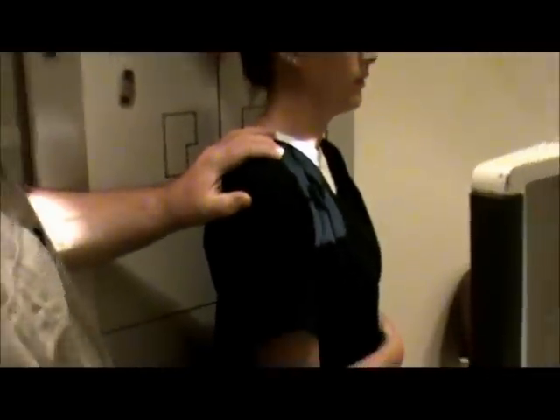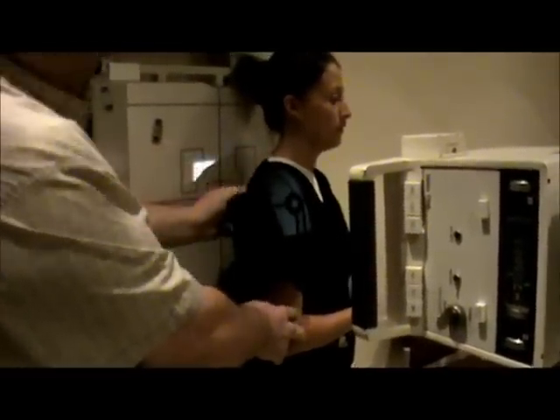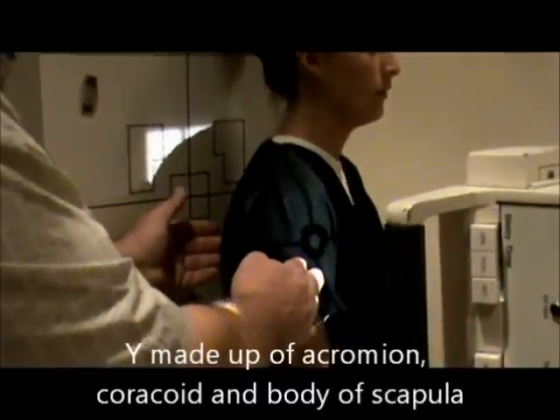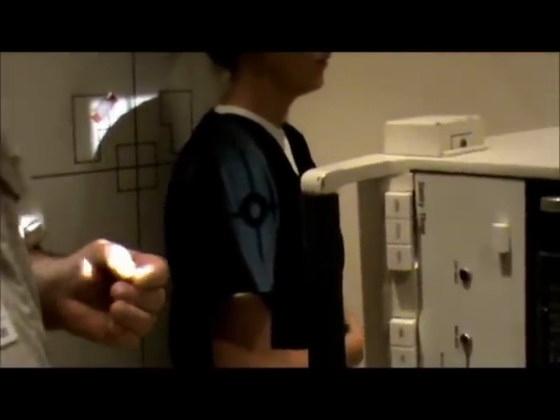From that point, we're going to have the arm across the belly — tell the patient to hold it still and don't move it. Keeping the arm across the abdomen prevents the patient from rotating. We're going to center from the top of the shoulder about three to four inches down. What we can see is what we call the Y-view — what makes up the Y is the acromion, the coracoid, and the body of the scapula. This view is done for anterior and posterior dislocations; anterior dislocations occur approximately 95% of the time, and 5% will be posterior dislocations.